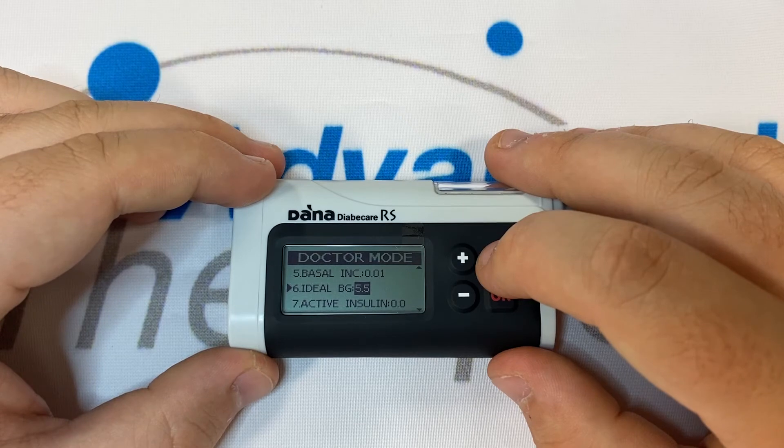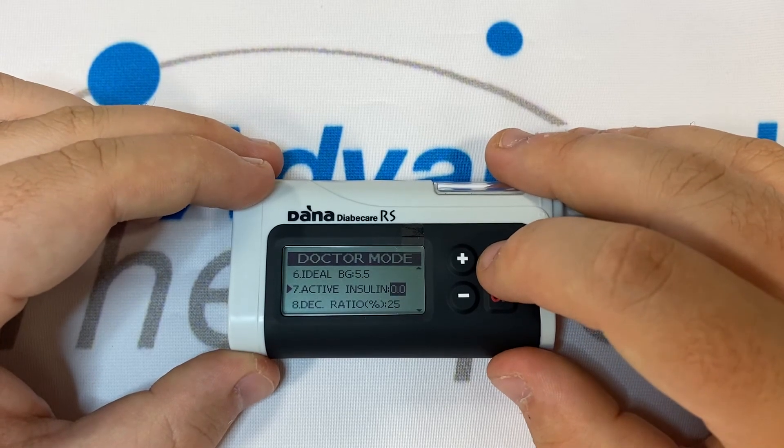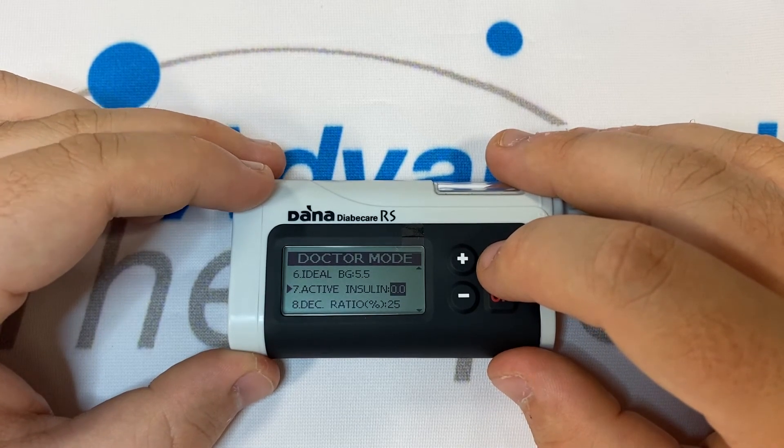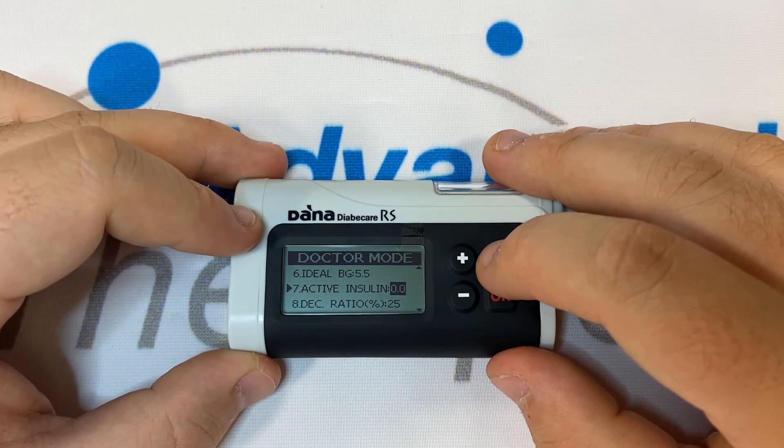Ideal BG is fixed, although you can change it in the calculator as you calculate for added flexibility. Number seven is Active Insulin — this is a reference value showing the insulin on board at that given moment. If the pump is new, this will be reading zero.